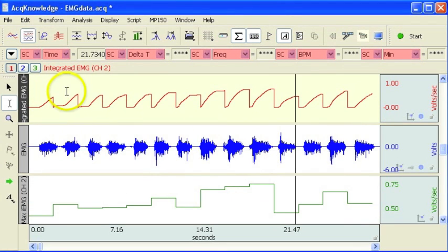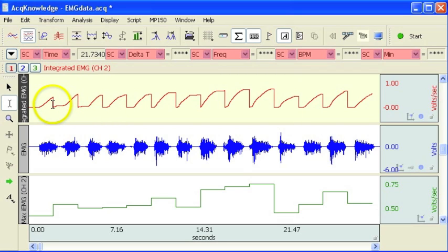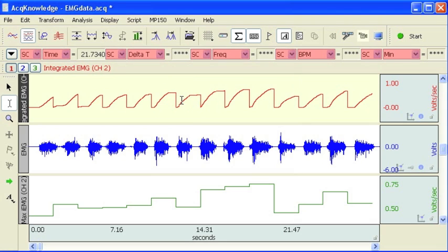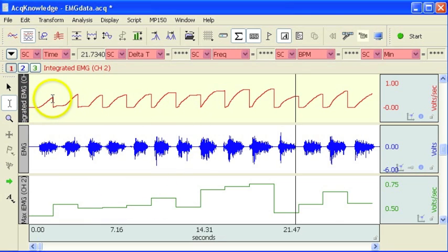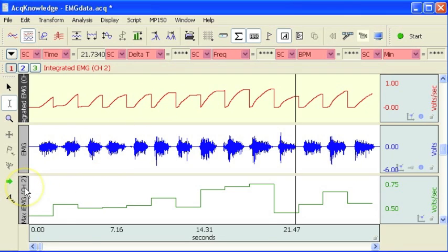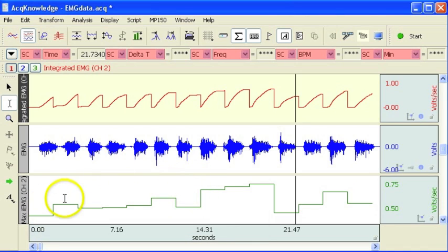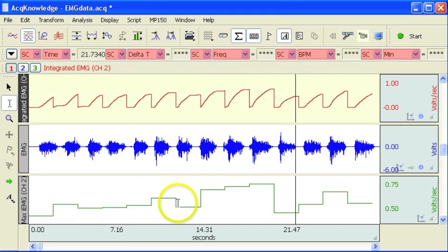Here we have a series of ramps, and you can see the waveform is reset at these 2 second bins. Obviously the higher this waveform, the higher the amount of EMG activity. In addition to giving the actual waveform — the integrated waveform, the sawtooth signal — we also give you the maximum integrated EMG for each of the 2 second bins.